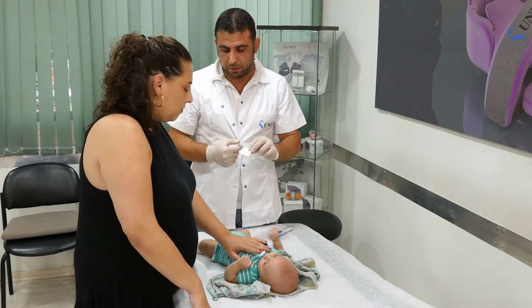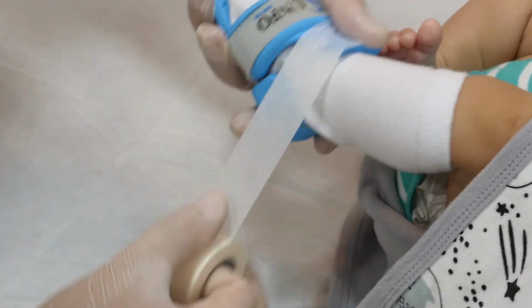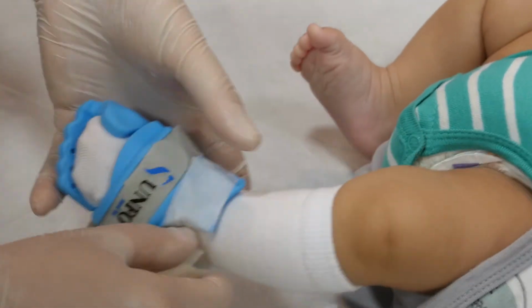If the baby removes the brace from their foot, check if it was set up according to the instructions. If so, we recommend wrapping the brace 3 times from the heel to the cushion using a medical paper Band-Aid.